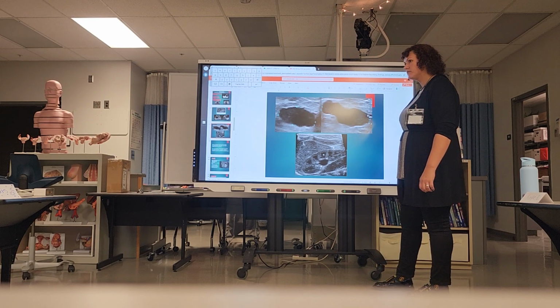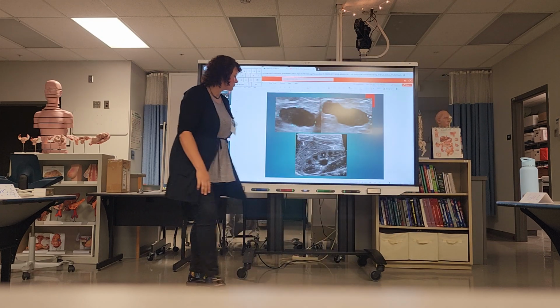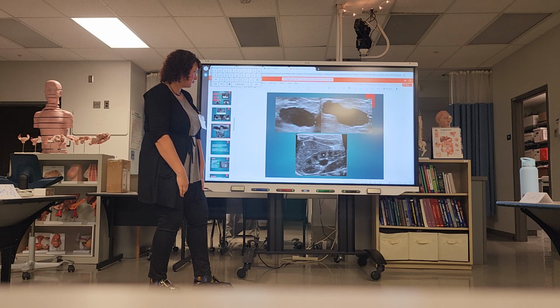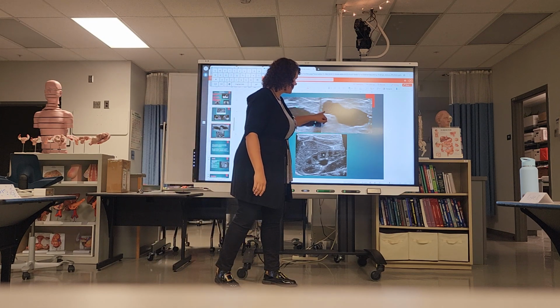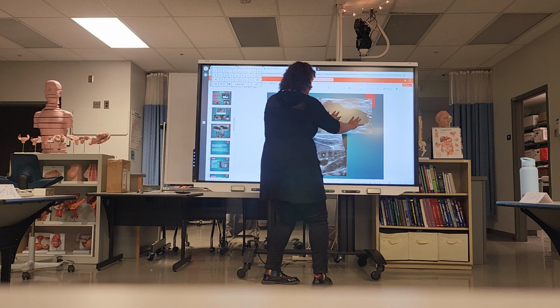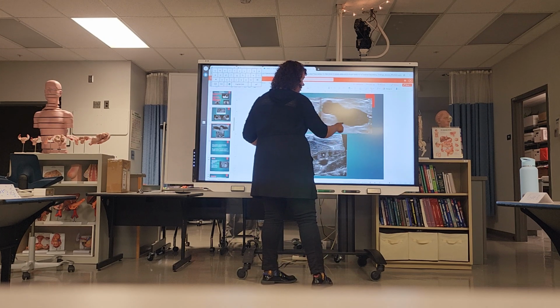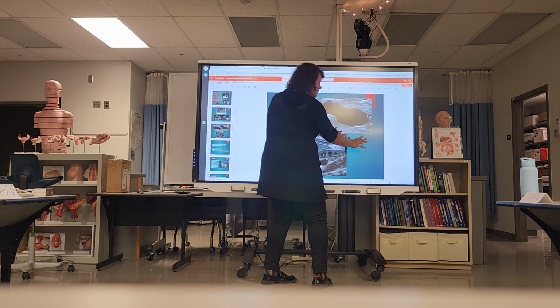Hypoechoic liver with. Yes. What is that white line on the bottom of those masses? Right here? Yes. What do you think that is? I think it's the wall. Okay, so enhancement would be a thicker white, correct? Yeah, not just the wall, posterior to it it would be like all of this tissue is bright.